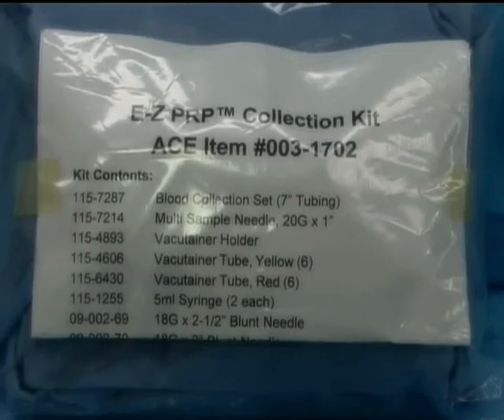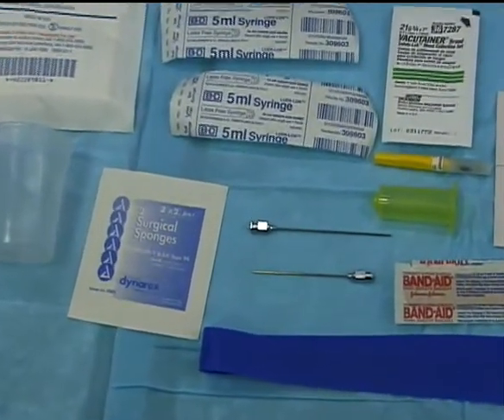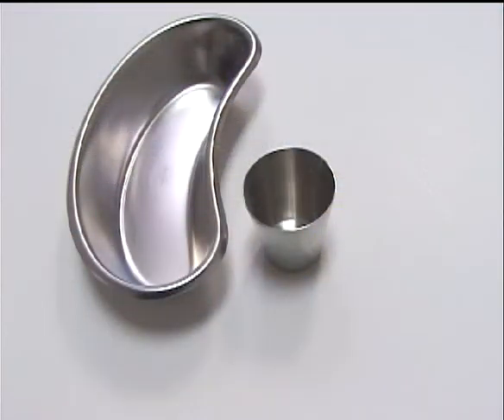All of the components for the platelet concentrating procedure come in a disposable kit. The two stainless steel blunt needles should be sterilized in standard fashion. At the same time, two 30-milliliter stainless steel containers and a small emesis basin should be sterilized as well.